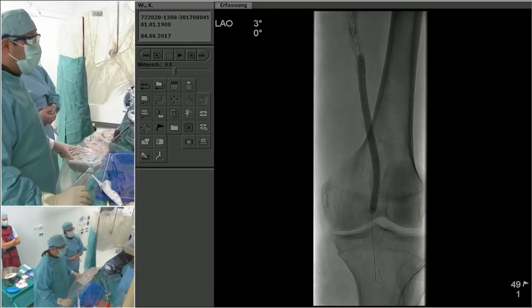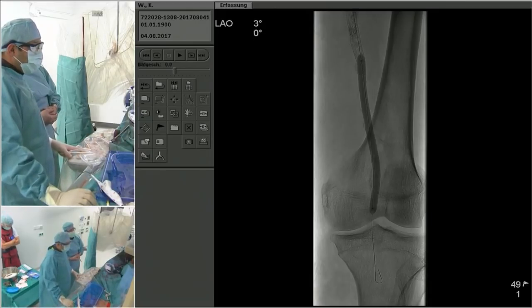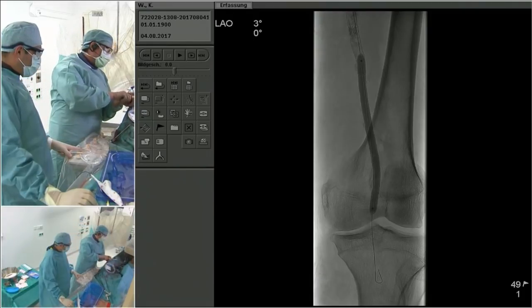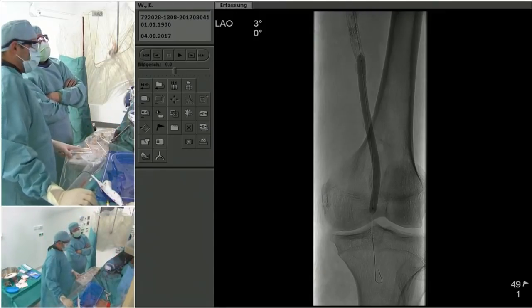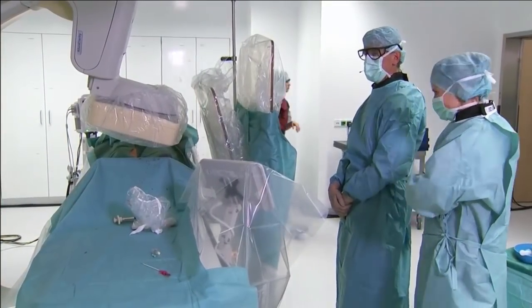And then if I can get through the cap proximally, I'll then de-escalate back to a somewhat safer wire. You are right, because you're often working high and low. You start 035, you work down to 014, you work back up to 035. That's sort of a common course. Any benefit in these cases, assuming that the profunda origin is fine, is take the sheath down.